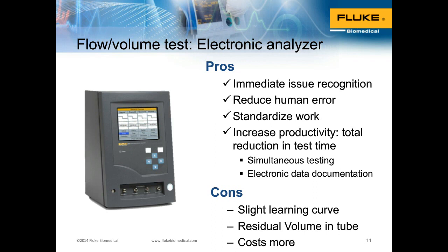And in many cases where I've been to medical facilities, I've seen that they've actually created a desk, a bench, which is specifically for infusion testing. And there's essentially deionized water bags that are connected to pumps, and they're just going through it so quickly. It's very, very impressive. Later on in the presentation, we'll get into what that means in terms of how much money you can save or how much time you can save, but that's something to consider when you're trying to decide which method you're going to go toward to test infusion pumps.